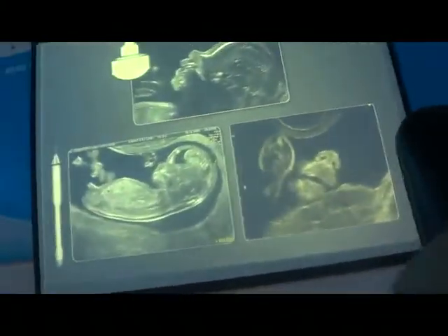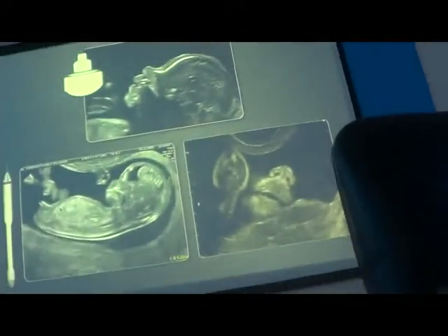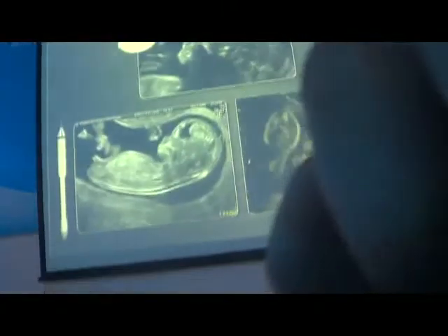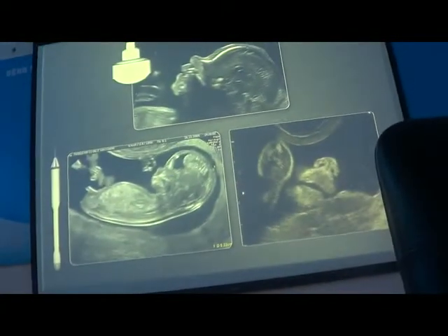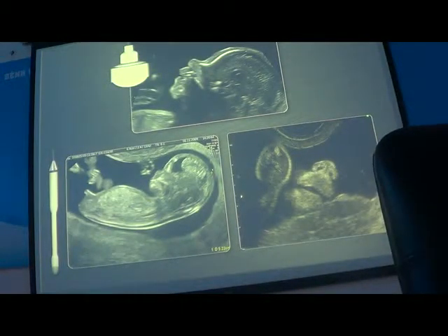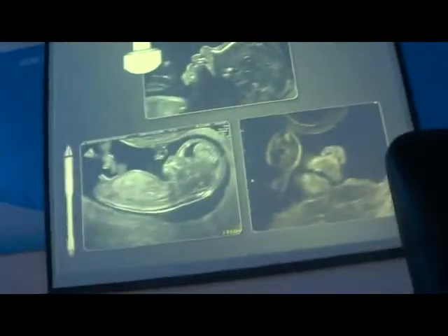But sometime in the second trimester, it's helpful to use a transvaginal probe when the head of the fetus is too low and the face is looking on the back and on the cervix. Tuy nhiên ngay kể cả ở quý 2 thì đôi khi đầu dò âm đạo cũng hỗ trợ các bạn rất nhiều, nhất là trong trường hợp đầu thai quá thấp.